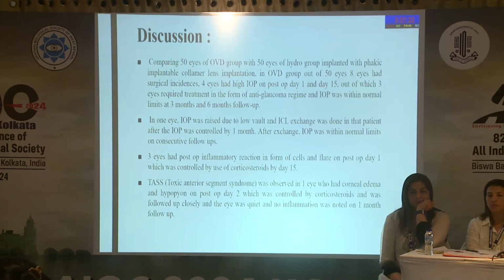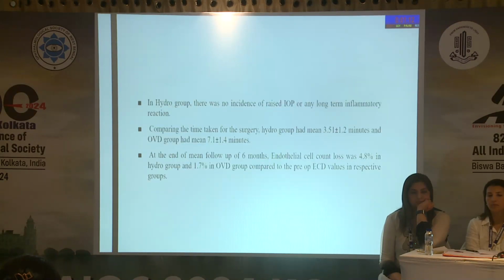3 eyes had post-operative inflammatory reaction in the form of cells and flares on the first day, and it was controlled by steroids. Out of these 3 eyes, 1 eye had a TASS-like picture, and it had corneal edema and hypopyon on post-op day 2, which was controlled by the steroids, and it was closely followed up, and the eye was quiet and no inflammation was noted at 1 month. In the hydro group, there was no such incidence of raised IOP or any long-term inflammatory reaction.